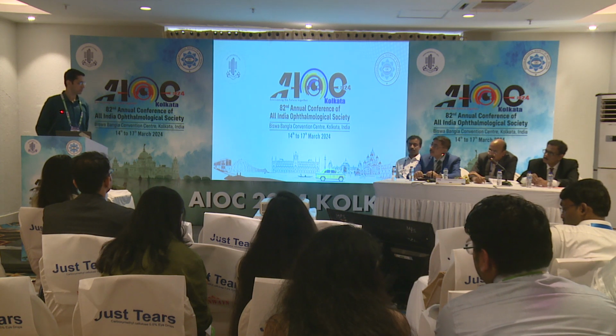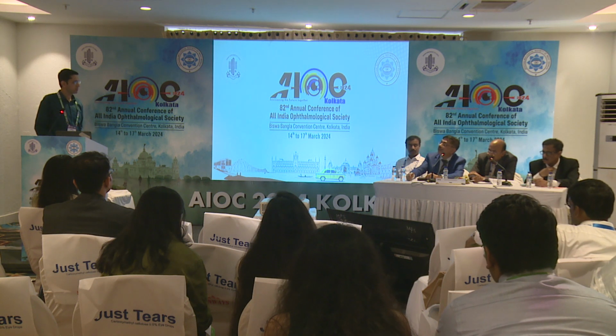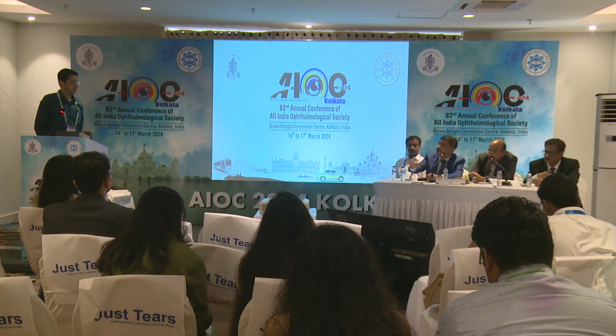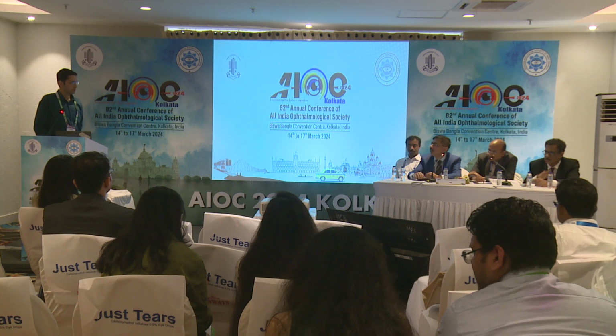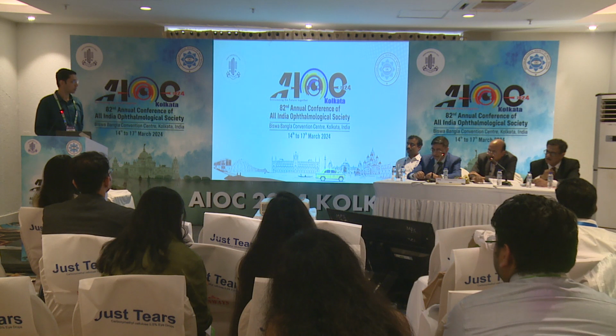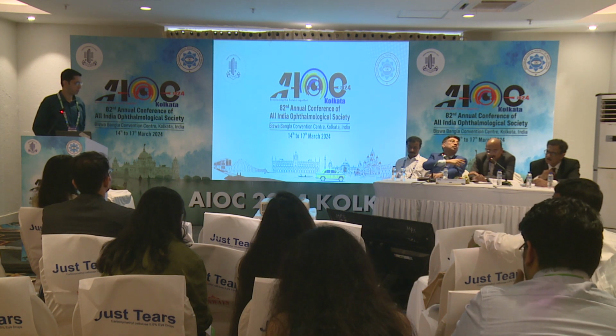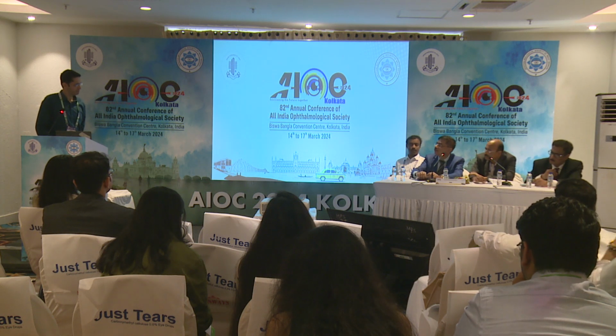This study assumes importance in view of the fact that all our efforts are directed towards DR screening. Yes, sir. If this can be combined with AMD screening, as we have been doing for a long time. It's a portable, non-mydriatic device, and it's offline AI, sir, so it does not need internet connectivity. Once it's deployed, it can be used. Thank you, sir.